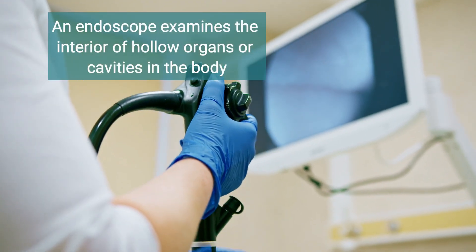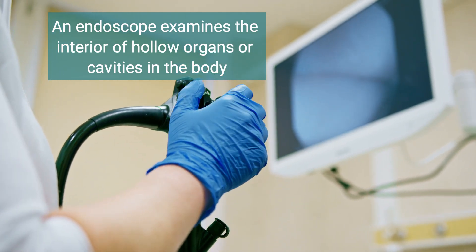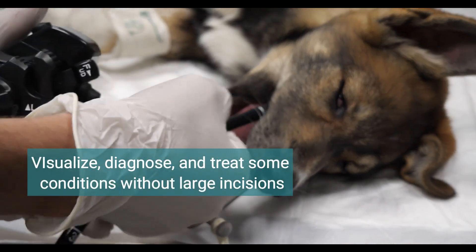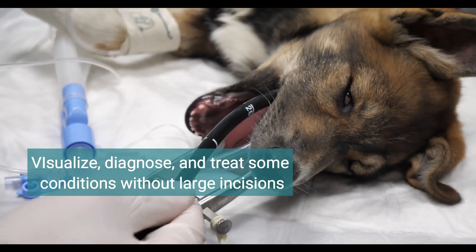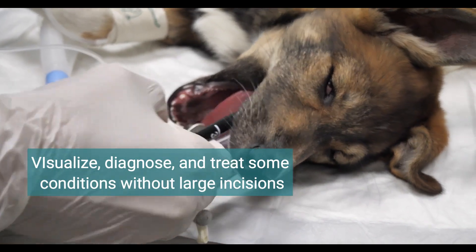An endoscope is a medical device designed to examine the interior surfaces of hollow organs or cavities in the body. It allows veterinarians to visualize, diagnose, and sometimes treat conditions inside the body without large incisions.